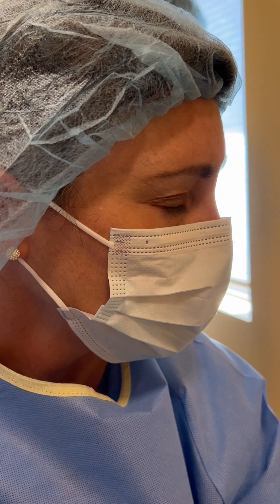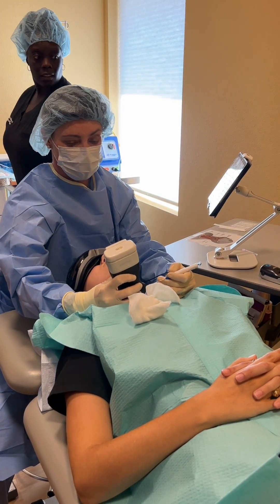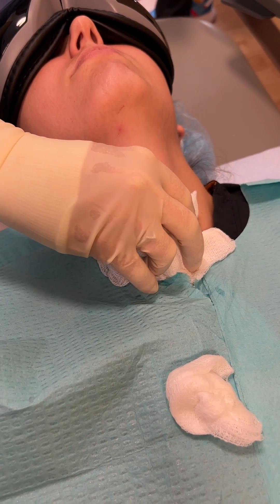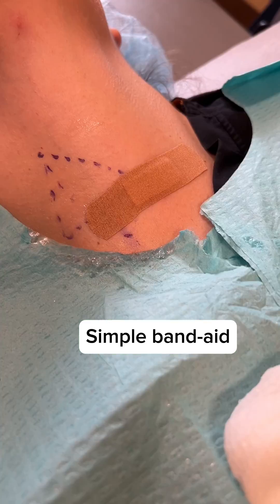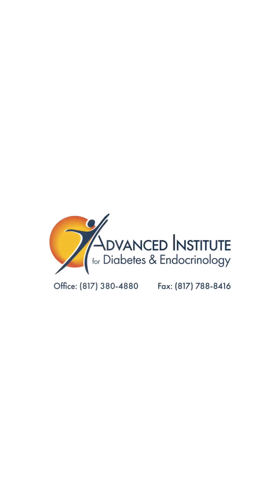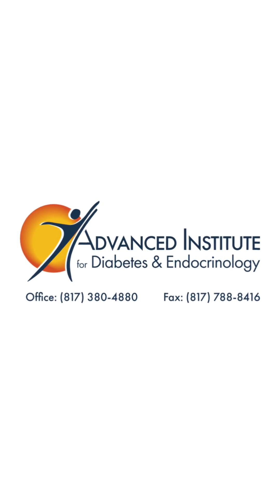Probe off. I think we're about done. Probe off. Thank you.